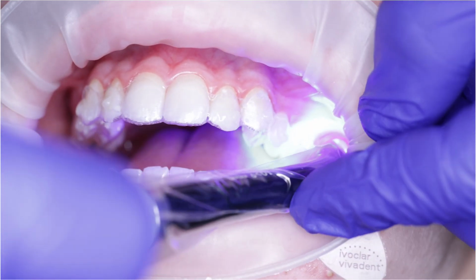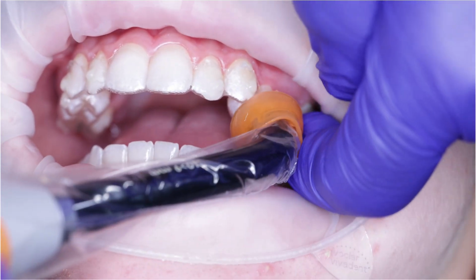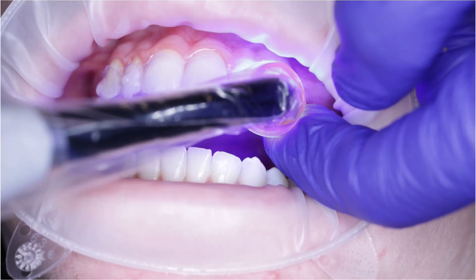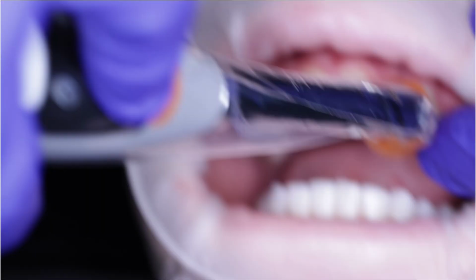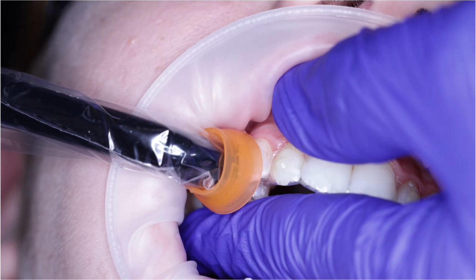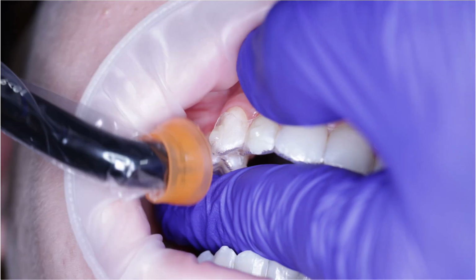And now we're ready to cure with our Bluephase PowerCure. Now, I'm holding it down. You'll see I'm holding the attachment template down and I'm curing every attachment. Now, this is a high intensity power light. It's only 3 seconds. So some of you may have a cure light that needs to be in the Smithsonian or might have 10 layers of composite on it. So make sure that whatever cure light you're utilizing, you're holding down the template. And you'll see me do that. And we'll do this again in our hands-on.